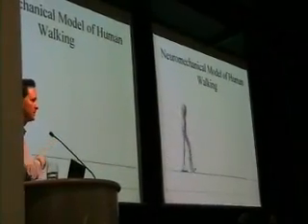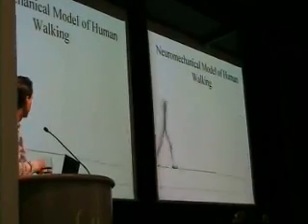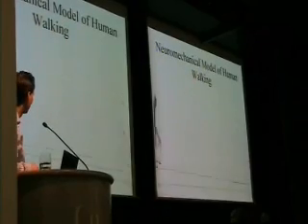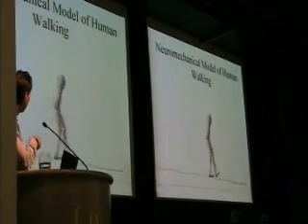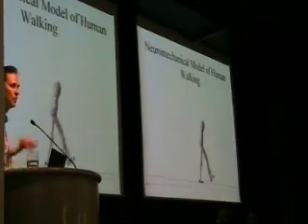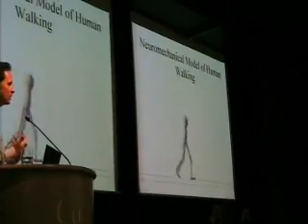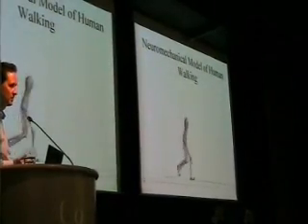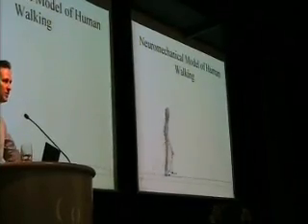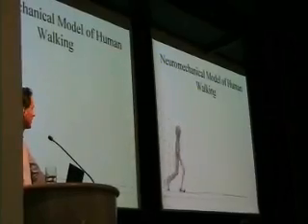This model of the human knows nothing about the ground surface, but it nonetheless can navigate these variations in ground surface without falling over. In this model, we've put in the muscles and the tendons and the skeleton, and what we believe to be the reflexes to the spinal cord. What's emerged is this extraordinary stability. Such a neuromechanical model informs us on how to design these robotic prostheses.